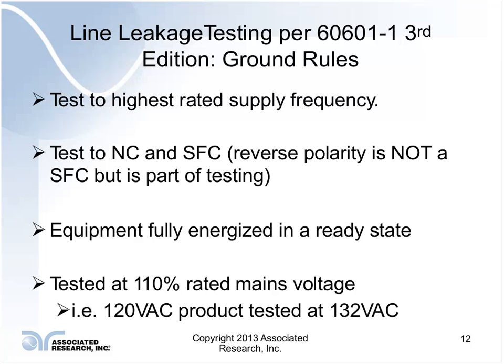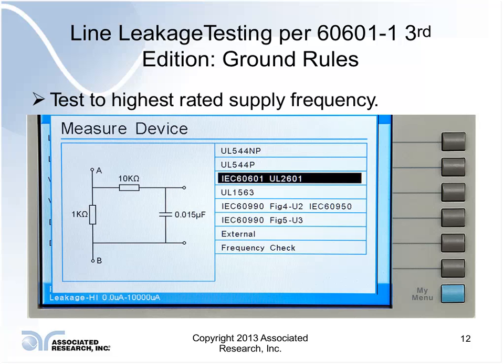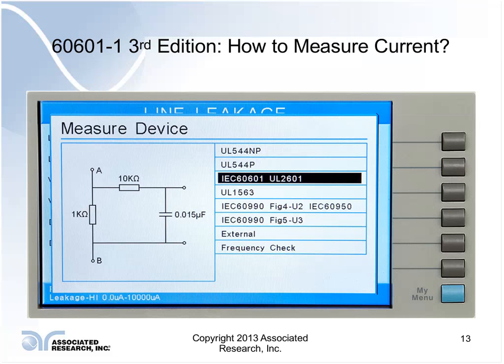You want a steady 110%, which is why I always recommend the use of an external power supply or a medical-grade isolation transformer, because you will get that steady power to do it. And then, of course, we need to measure it. Now, I already mentioned a measuring device.